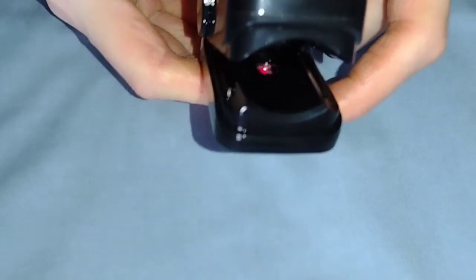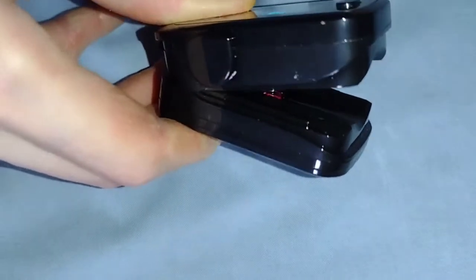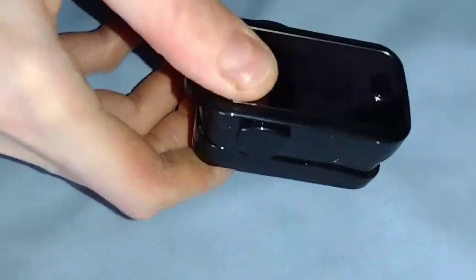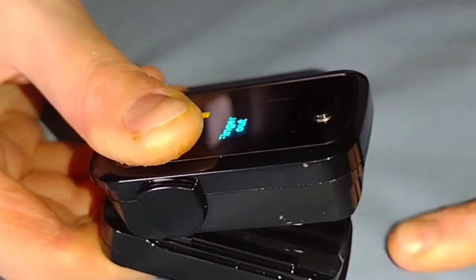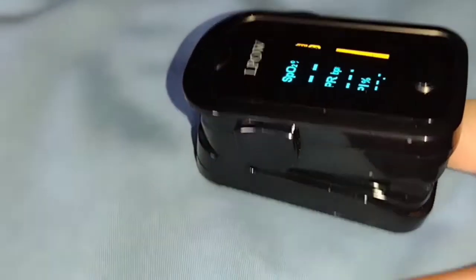Inside the oximeter there is a high-precision infrared probe — that little red light you see right there. You want to make sure that when you put your finger into the oximeter, your finger is over that red light, otherwise you're not going to have an accurate measurement. You can see the red light and there's my finger right on top of it.